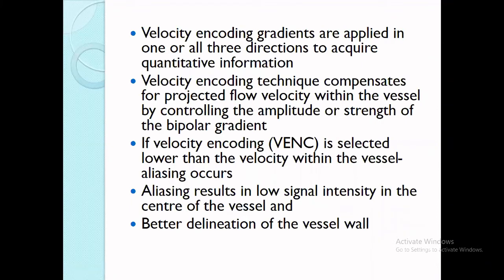Okay, velocity encoding gradients are applied in one or all three directions to acquire quantitative information. Now, what do you mean by gradients applied in one or all three directions? It means we can apply it only for the phase gradient, or we can apply it for the frequency encoding as well as for the slice selection. If we apply all three, we call it all three directions.